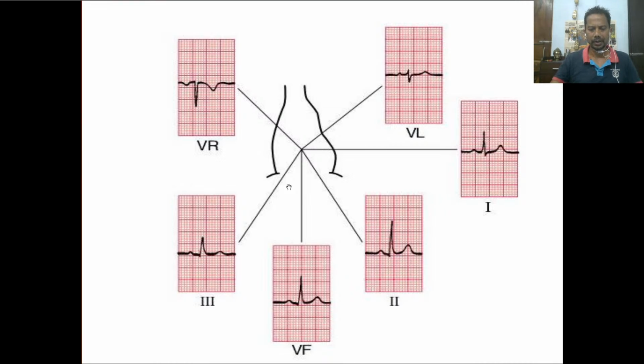when we are discussing the ECG also. Now draw that circle in your mind around this picture, that same circle. Lead 1 is at 0 degrees, aVF at plus 90 degrees, like that. Whenever the impulse is coming towards the positive pole of any of the electrodes, it is perceived as an upright deflection, like an R wave. Out here you can see this is an R wave. And whenever the impulse is going away from the positive pole of that electrode, it is perceived as a negative wave, S wave.